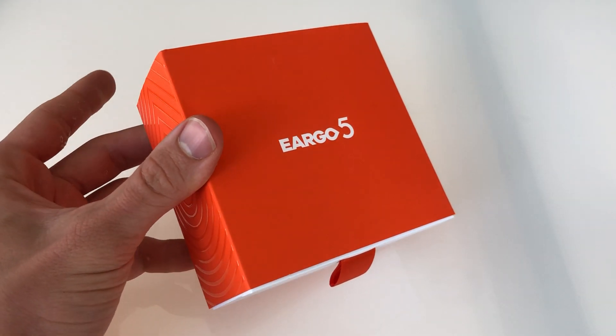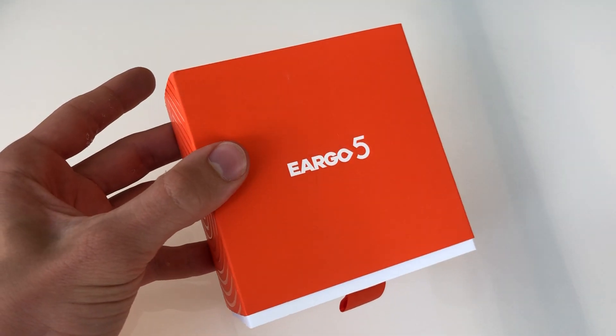Hello, this is Dr. Ben Thompson here. Today we will unbox and open the Eargo 5 hearing aids.